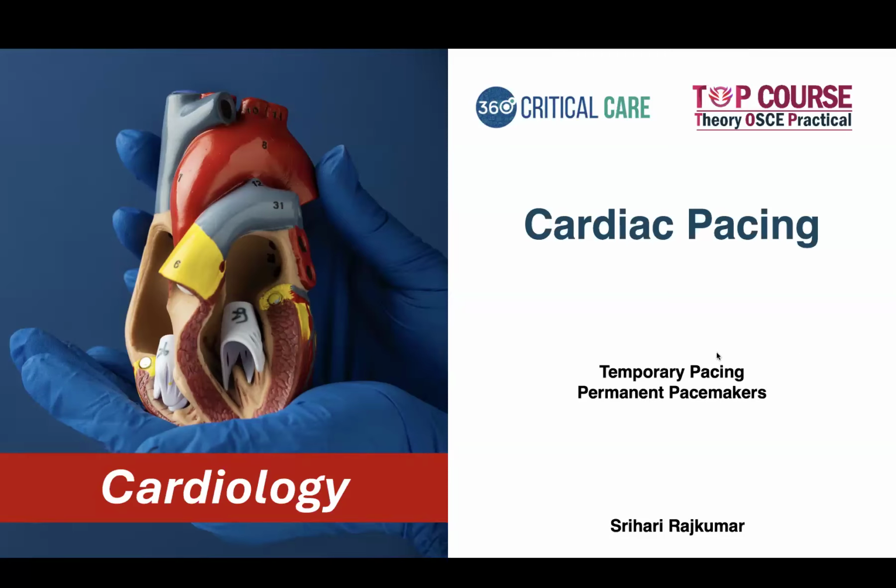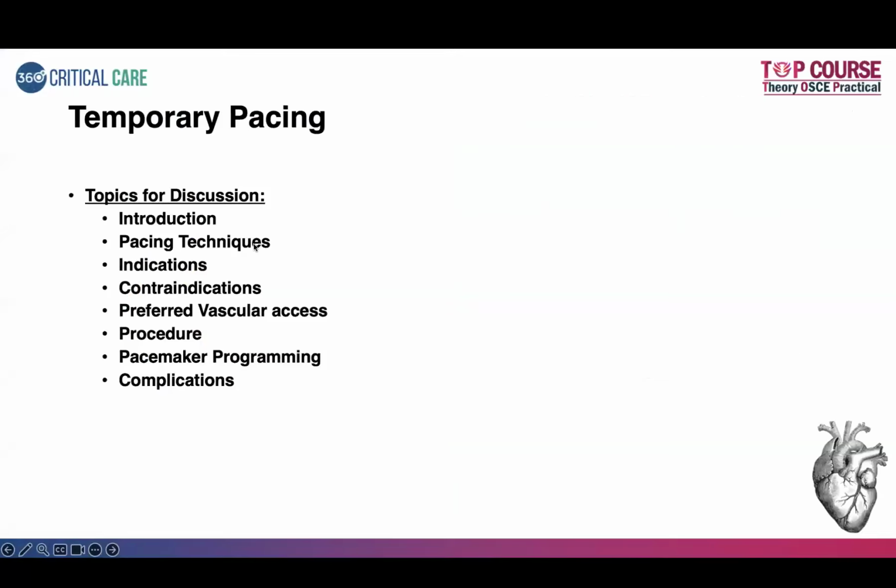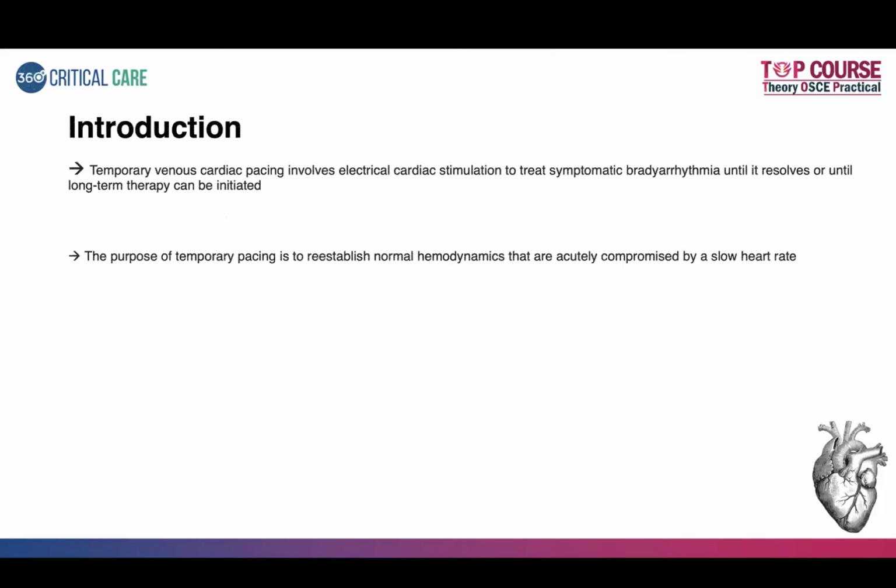So first, coming to temporary pacing. These will be the topics I'll be discussing: the introduction, pacing techniques, indications, contraindications, preferred vascular access, procedure, pacemaker programming, and complications. So coming to the introduction, temporary venous cardiac pacing involves electrical cardiac stimulation to treat symptomatic bradyarrhythmia until it resolves or until long-term therapy can be initiated. The purpose of temporary pacing is to re-establish normal hemodynamics that are acutely compromised by a slow rate.